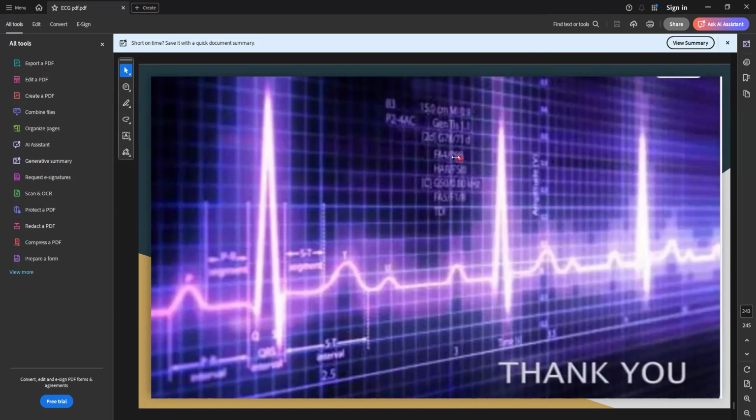Hello, ma'am. Yeah, tell me. Sir, regarding V7, V8, V9, what should be the position of the patient if you are keeping these leads? Supine position only you have to keep. Always the ECG should be taken in the supine position only.